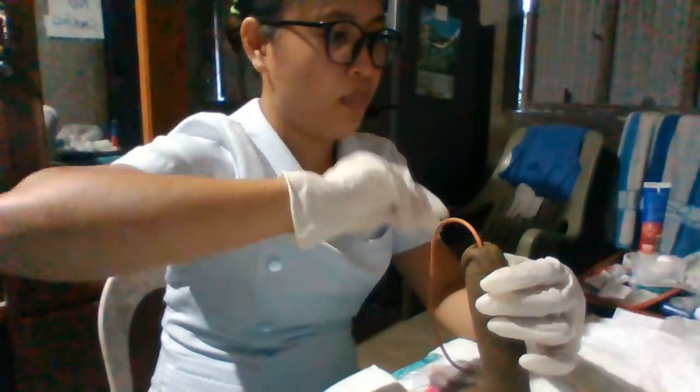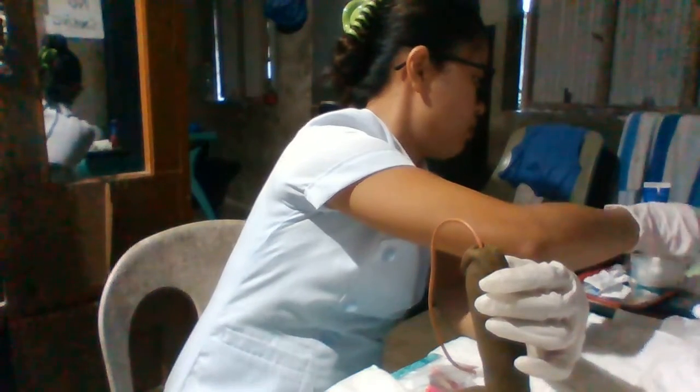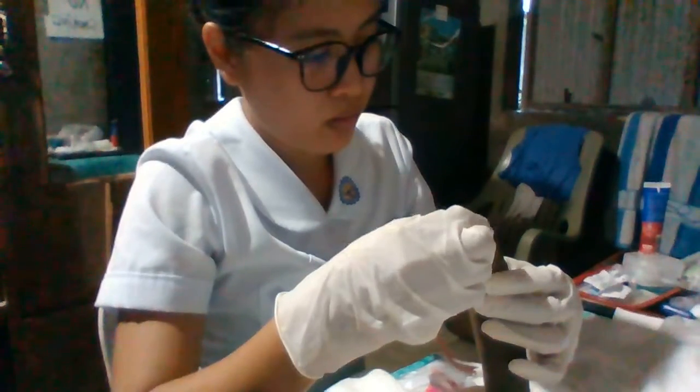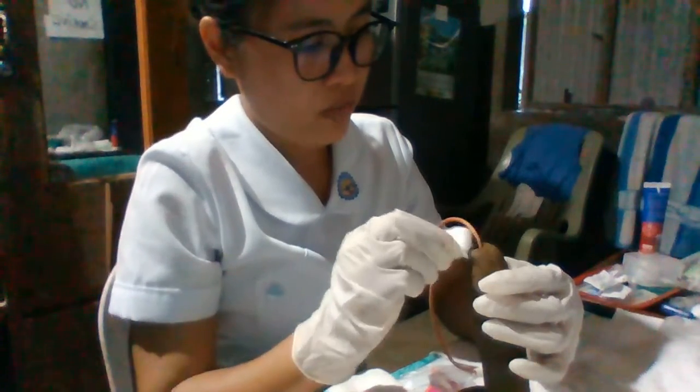Afterwards, apply antiseptic ointment at the urethral meatus along 2.5 cm of the catheter.